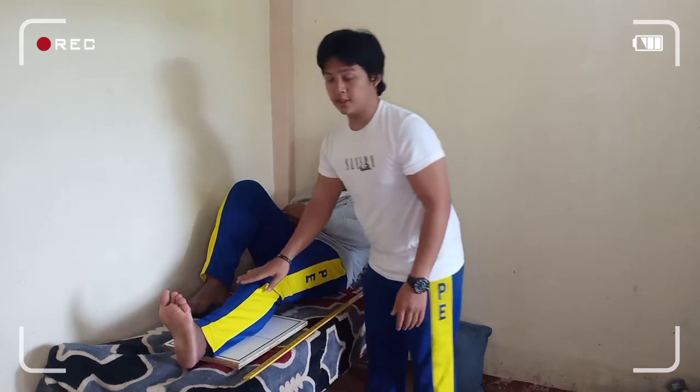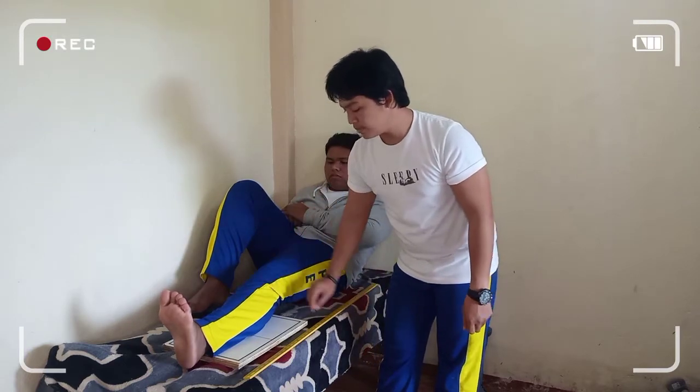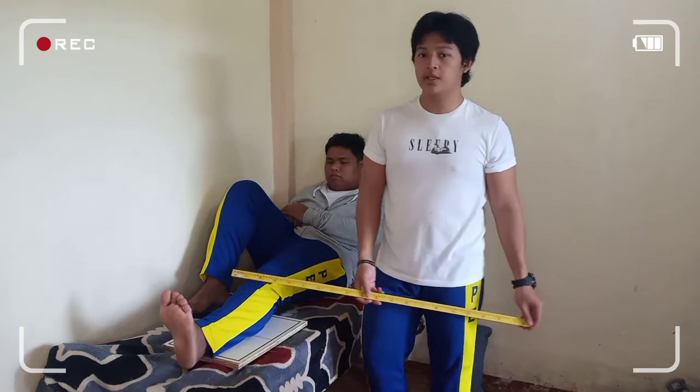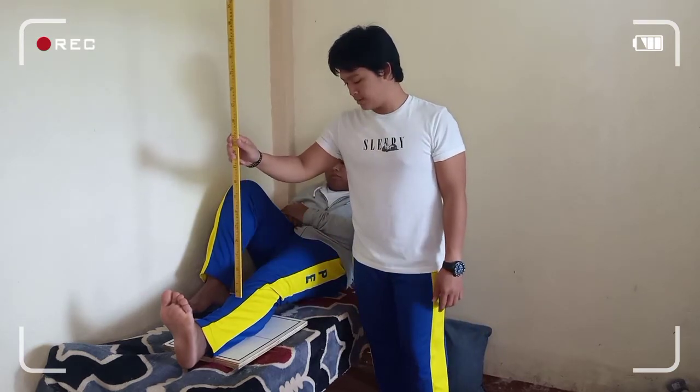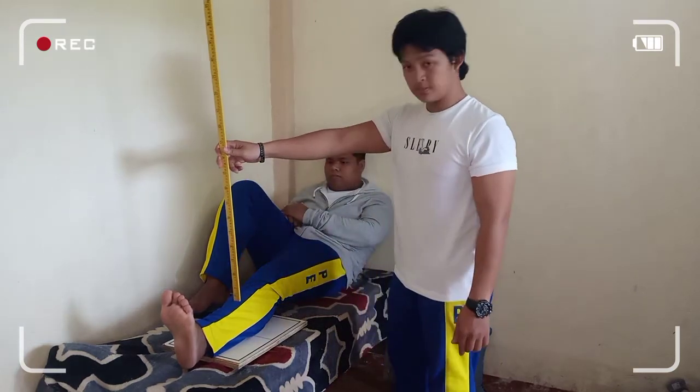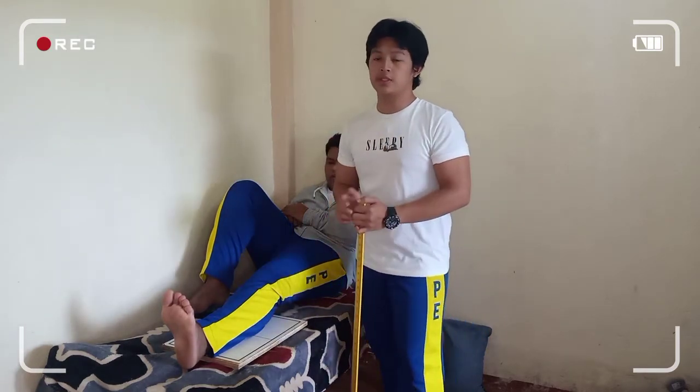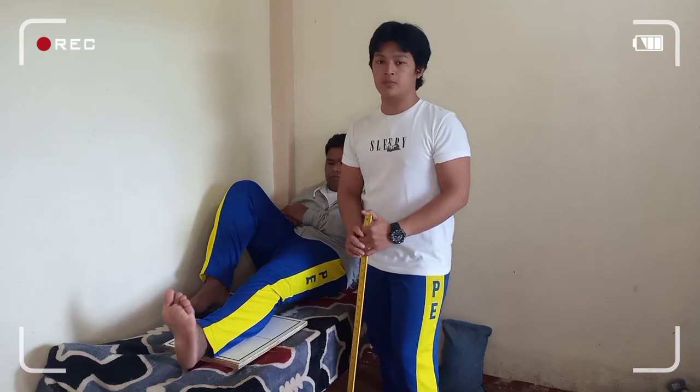Para proper yung kanyang anatomy. And the central ray must be perpendicularly directed to the mid-leg. The structure shown in this projection is the tibia and fibula.